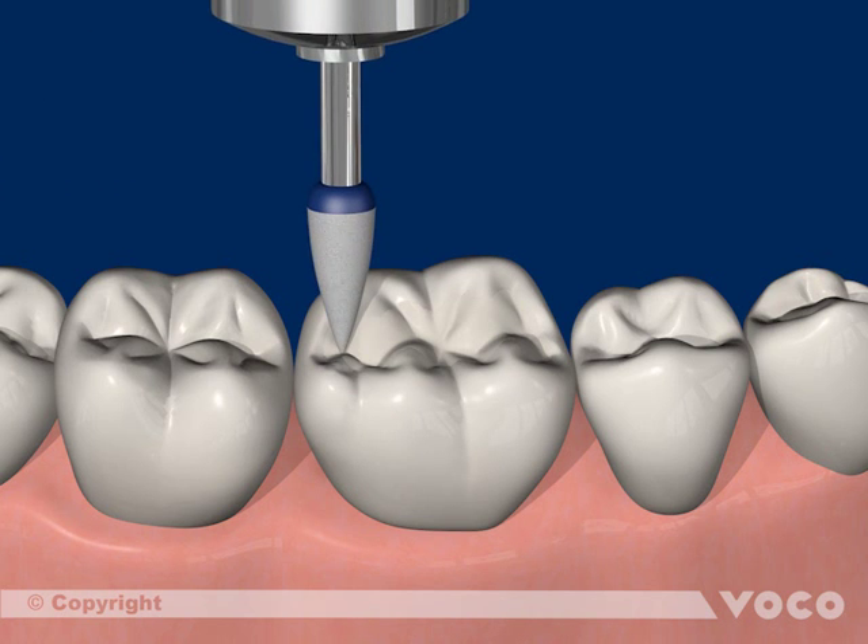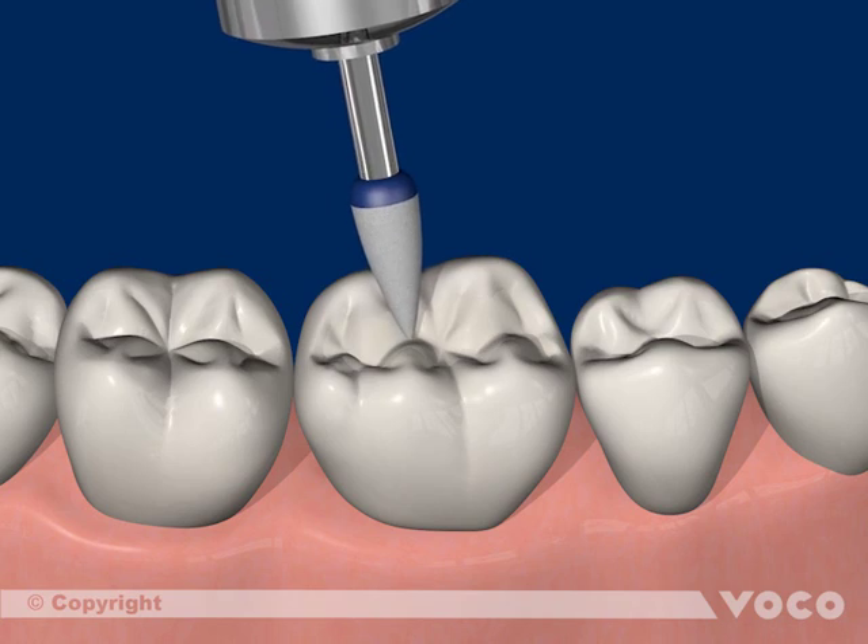After that, the occlusion surfaces are modeled, polymerized, elaborated, and polished and enhanced.